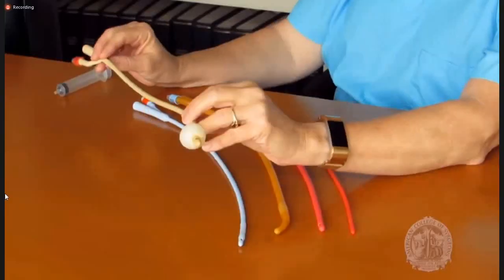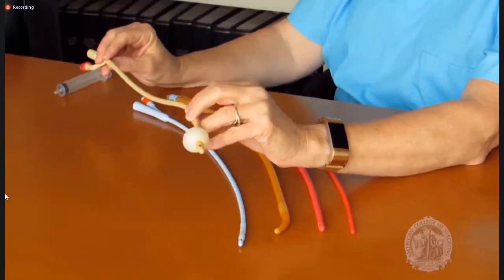I've talked about both indwelling and non-indwelling catheters, so it's probably a good time to talk about that a little more. Indwelling catheters, such as this one, are placed under sterile conditions and have a balloon at the end to ensure that they stay inside the bladder. They're used when the patient will need catheterization for several days. The most common type of indwelling catheter is a Foley catheter like this one. It comes in various sizes, measured using the French system. On the internal end, it has a balloon to ensure that it stays in place.